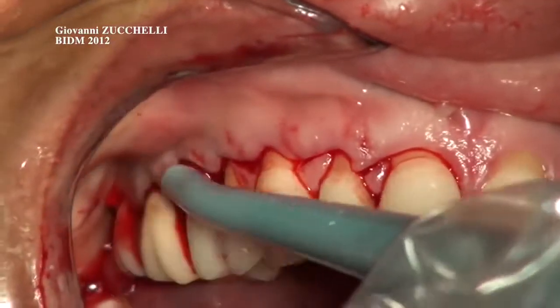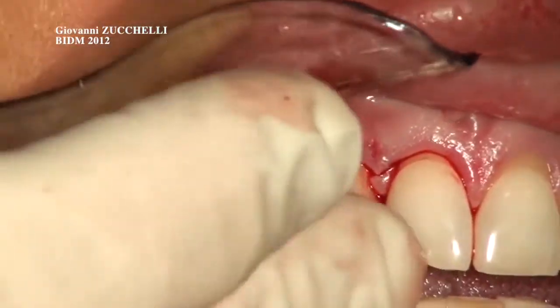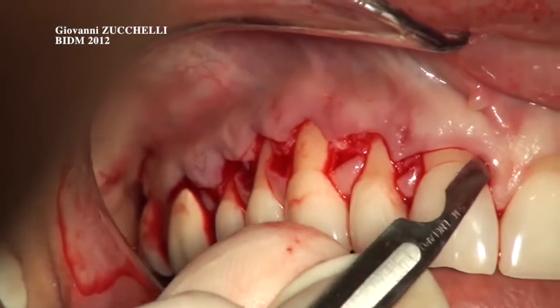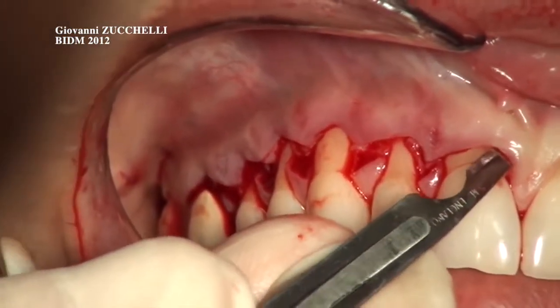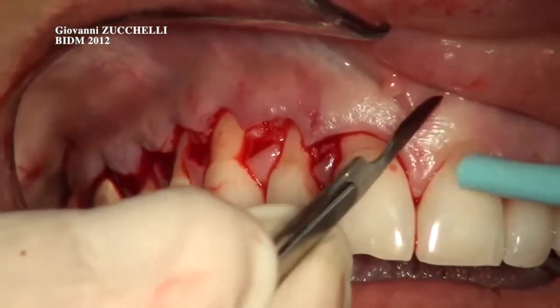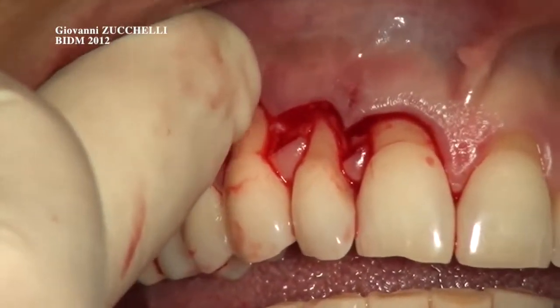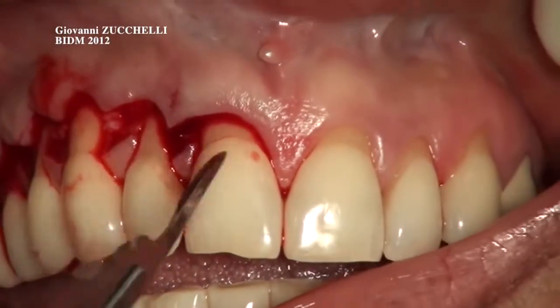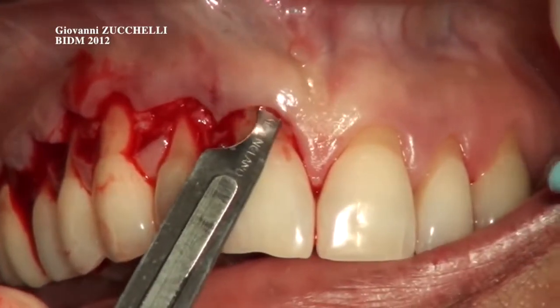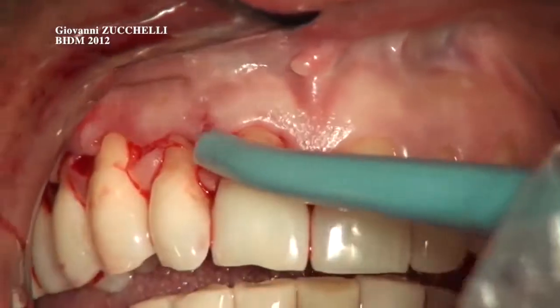So now I have to complete this area in the most apical aspect, below the mean frenulum here, elevate the interincisor surgical papilla, detach the mean frenulum, and go further apical. You have to pull this, otherwise you don't see if you're making perforation of this area. It's very important that you see the entire vestibulum depth in order to remove the frenulum from the inside and make the surgical papilla rotate in a very passive way.